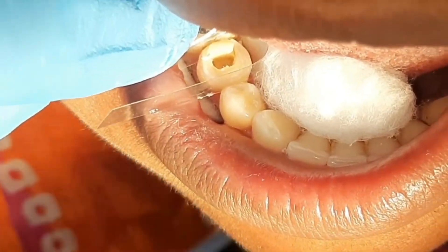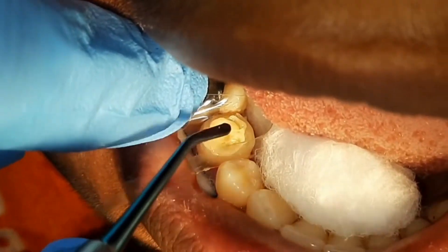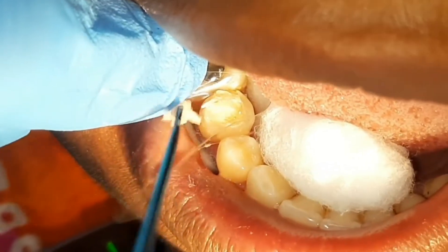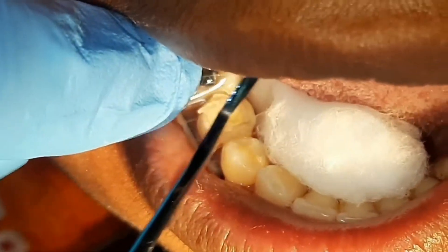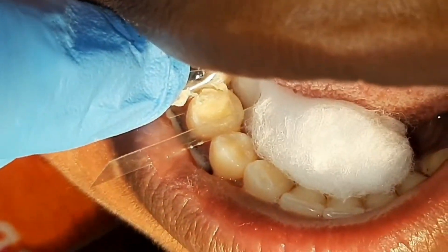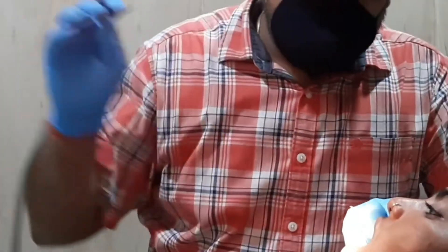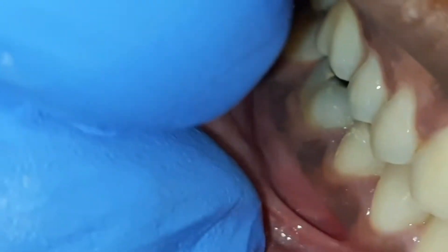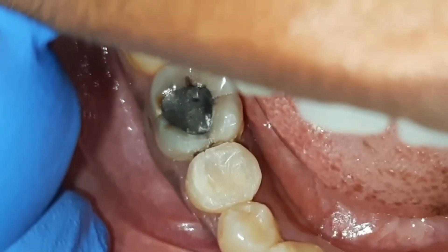I always prefer this approach first. It's almost done — final curing, and now a little bit of carving with an articulating paper. Now let's do crown preparation on it. This is the zirconia crown. Thank you friends for giving your valuable time.